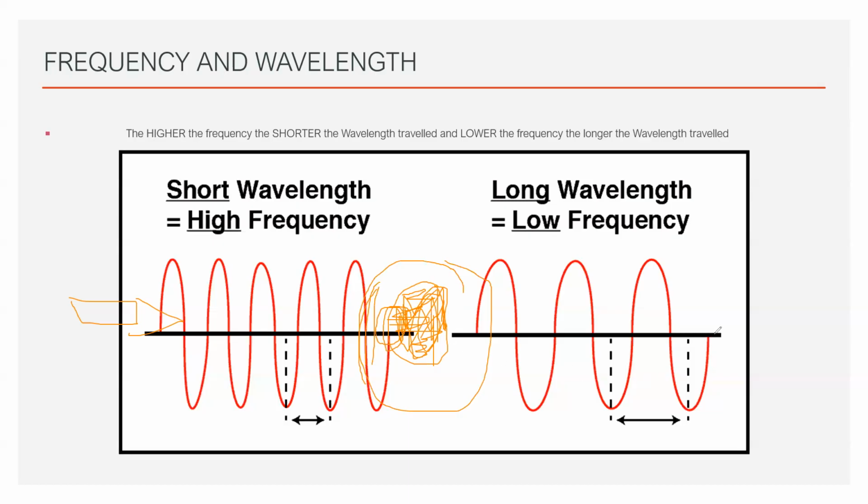On the other hand, if you use a low frequency probe where the wavelength between each sound wave is long, then a sound wave appearing before the next sound wave appears means that this sound wave will be able to travel a longer distance. Because it travels a longer distance, it will allow you to see deeper tissue much better. The only challenge from our perspective is that as it moves, there will be attenuation again. And this attenuation can affect how we view images. Naturally, if you want to see deeper structures, you want to keep a lower frequency.